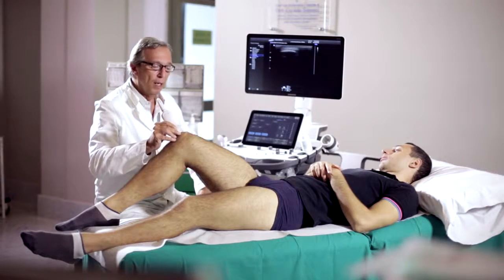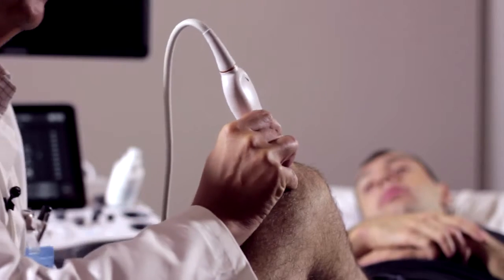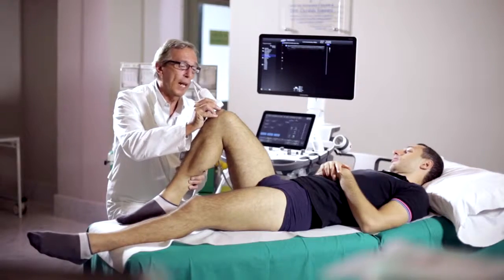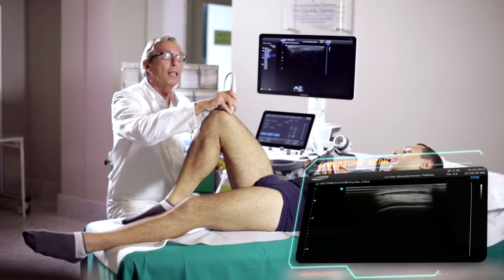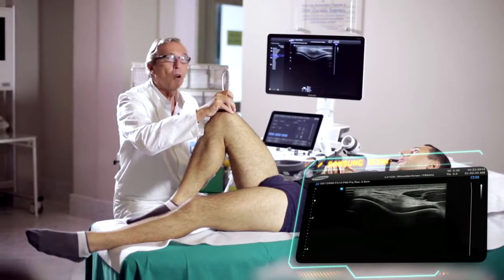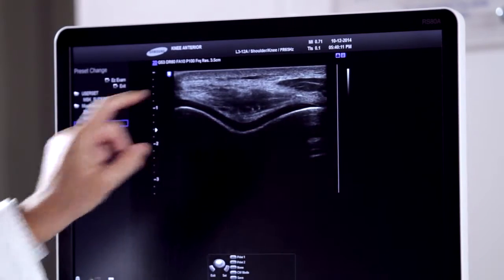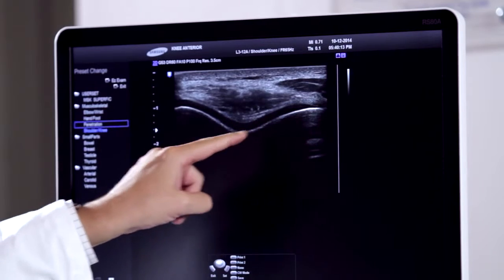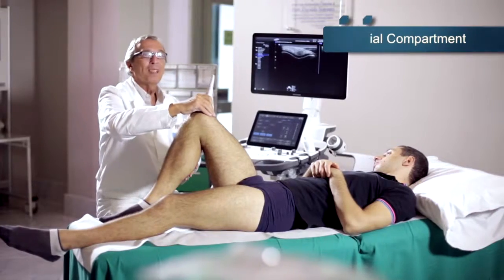We move now for the final scan on the anterior compartment. We will ask the patient to flex his knee, possibly more than 90 degrees, in order to target a very important cartilage structure that lines the femoral trochlea. Here, we can appreciate this homogenous hypoechoic aspect above the cortical bone component, which represents the articular cartilage at the level of the femoral trochlea.